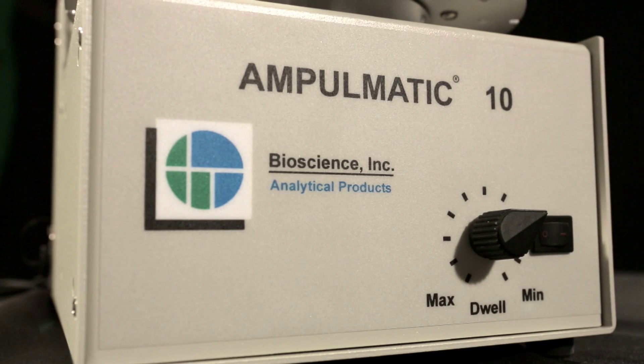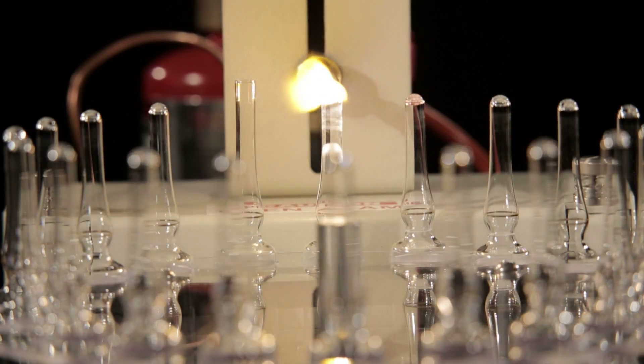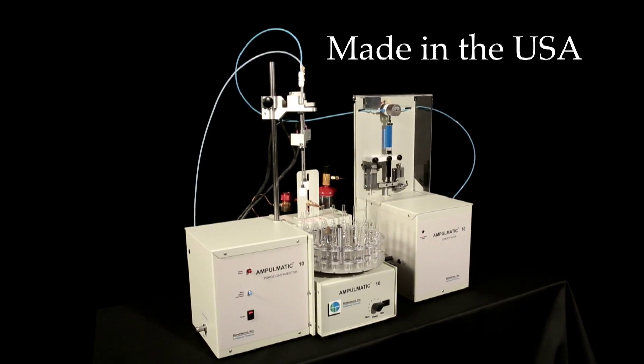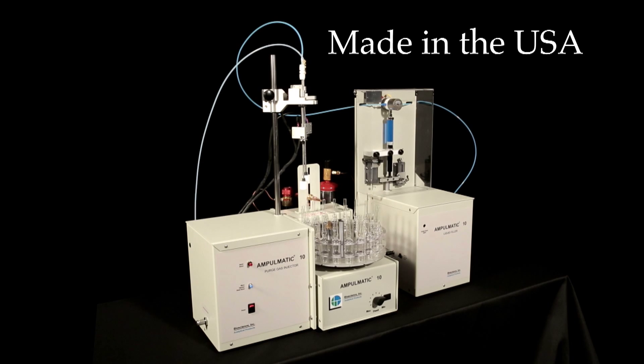Nothing else on the market fills these volumes at these speeds with this accuracy, adjustability, and seamless integration. The Ampumatic 10 Ampule Filler and Sealer System, exclusively from Bioscience.